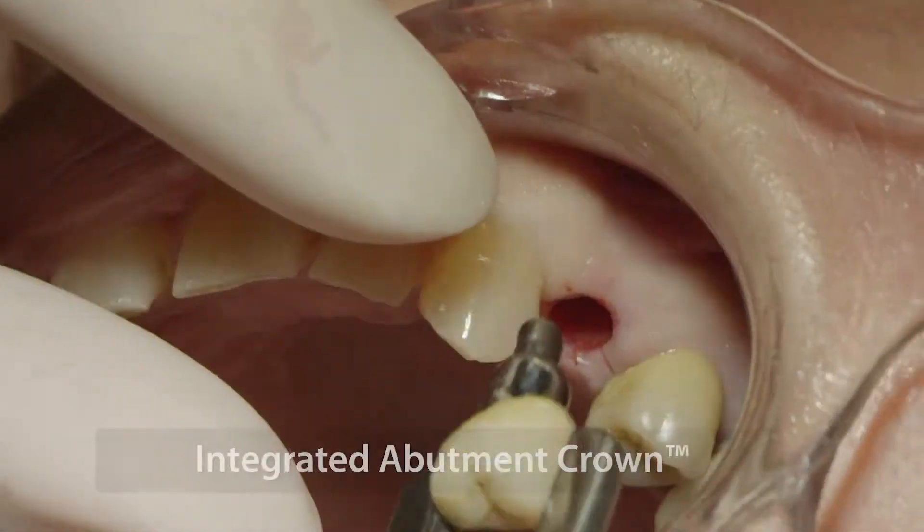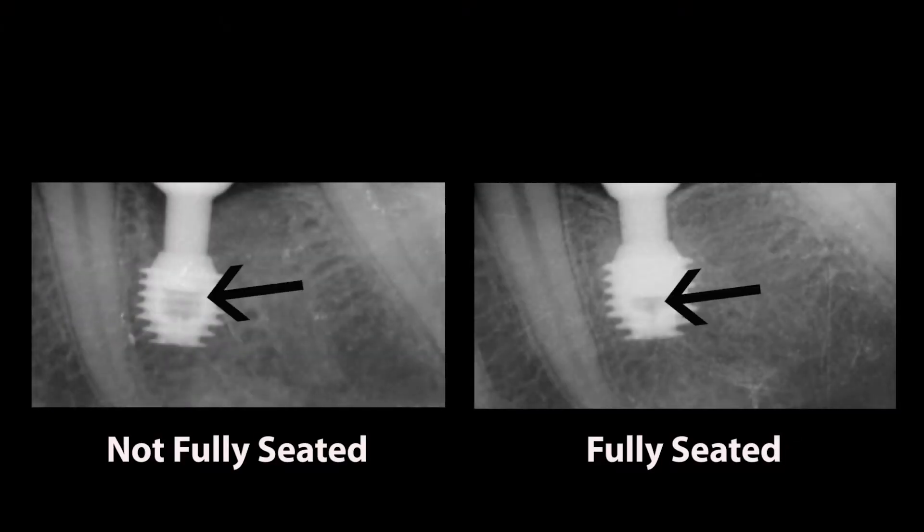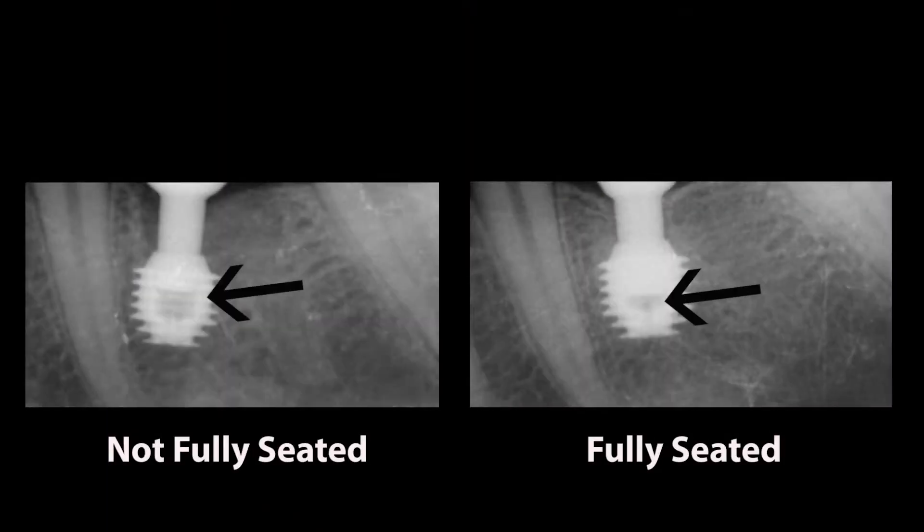When inserting a crown, you may notice that it's loose or there is occlusal discrepancy, which may suggest that it's not fully seated. In these situations, we should take a radiograph to verify the proper seating of the crown. However, a radiograph cannot confirm precisely if the crown is fully seated, since when you tap a crown in place, the shaft will move inside the implant well about a tenth to a quarter of a millimeter, depending upon the diameter of the implant well or the diameter of the abutment shaft. Our eyes cannot actually tell if the abutment has seated a tenth or a quarter of a millimeter. So the radiograph will tell us if at least we are in the ballpark of the crown insertion or if we are completely off, showing that bone is impinging upon the hemispherical base of the abutment, preventing the abutment from being close to the proper and final position.